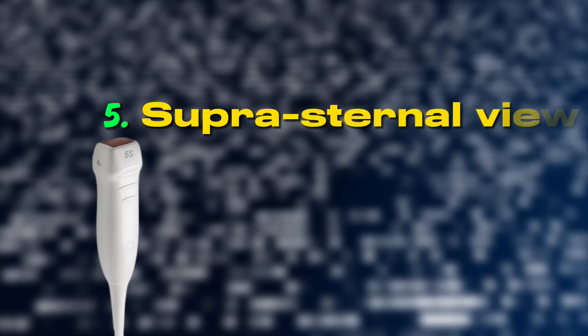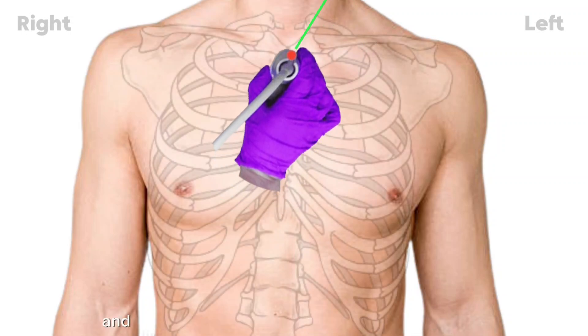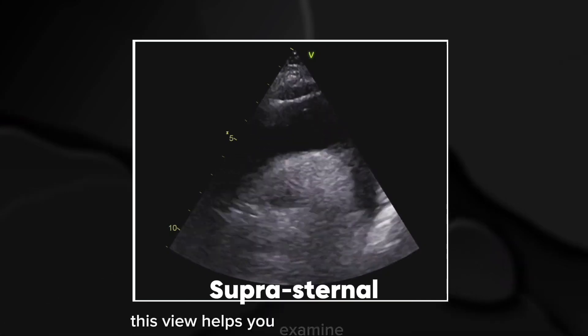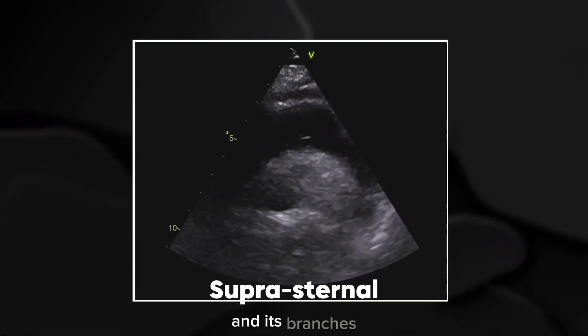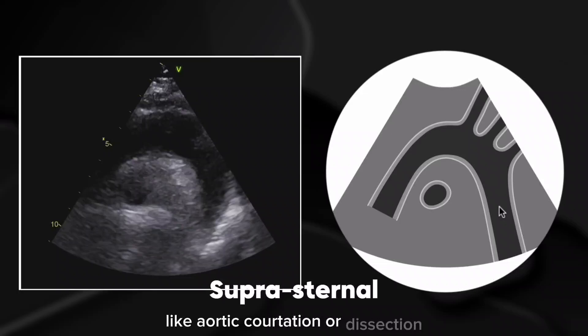Supra-sternal view — looking at the great vessels. Place the probe in the supra-sternal notch and direct the marker towards the patient's left ear, around the 1 o'clock position. This view helps you examine the aortic arch and its branches, which is particularly useful for detecting conditions like aortic coarctation or dissection.